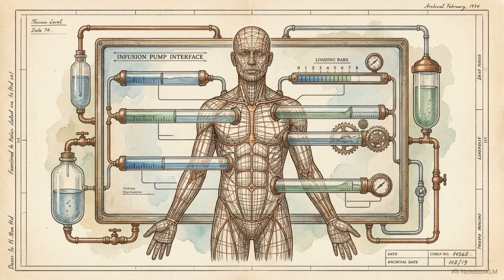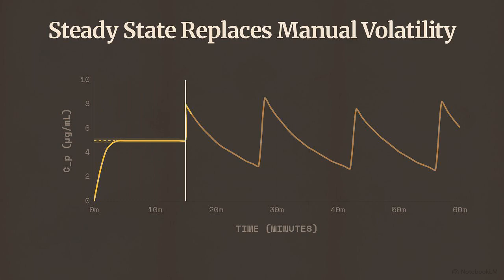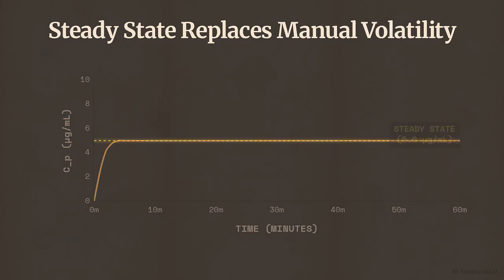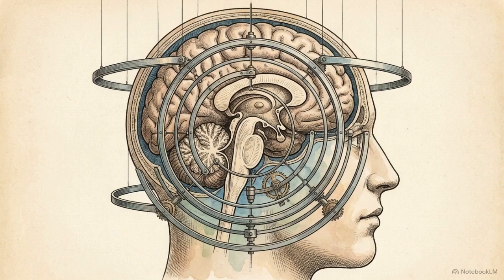Target Controlled Infusion systems operate as continuous, real-time pharmacokinetic simulations of the patient. Look at how the delivery changes. The erratic spikes of a manual delivery are corrected into a flawless, steady-state concentration. By deconstructing the algorithms driving this system, specifically a single mathematical constant known as Ke0, we can map exactly how the machine targets the brain.